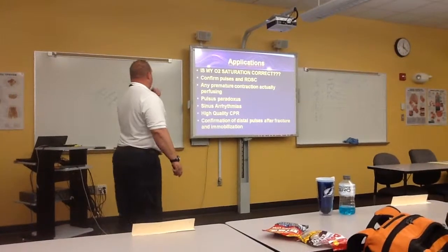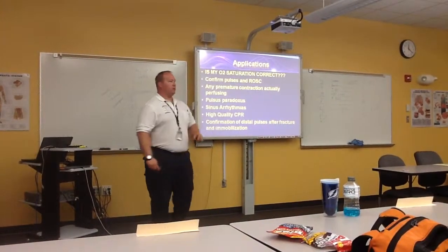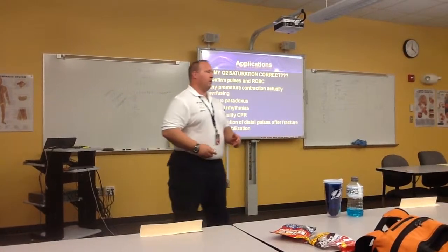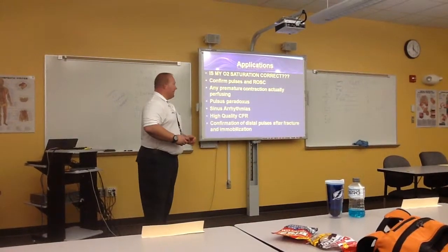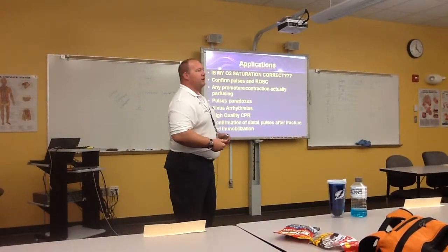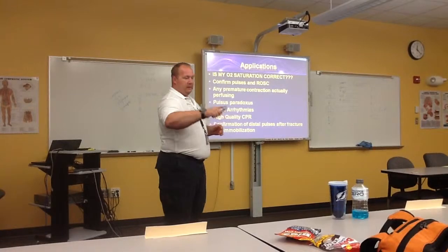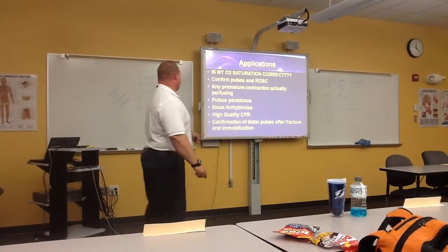Okay? You can confirm pulses in ROSC. You get a patient back. You hook up a pulse ox. I'm not saying put it on during CPR, but if you have time or it's already on, it's something that you can observe quantitatively. Are any premature contractions actually perfusing? Are the PVCs or PACs that we see actually contributing to blood pressure? That's something that you can determine. You can print it and show it. Look, doc, the PVCs are actually contracting. I have a waveform with each PVC.